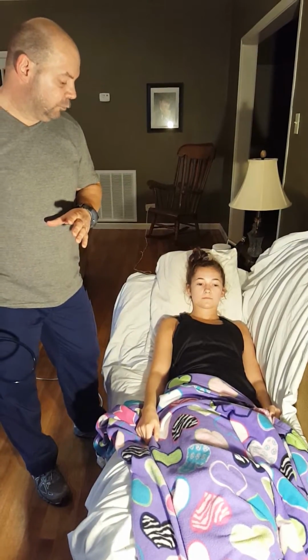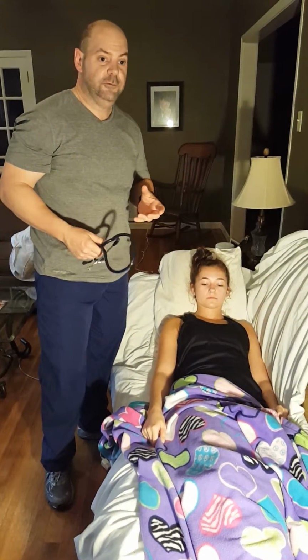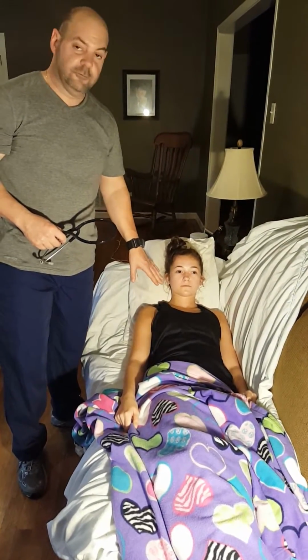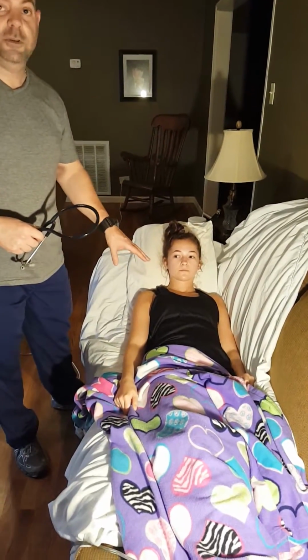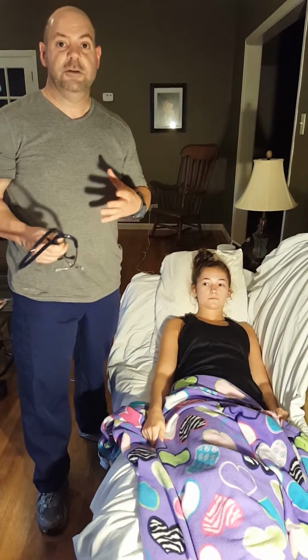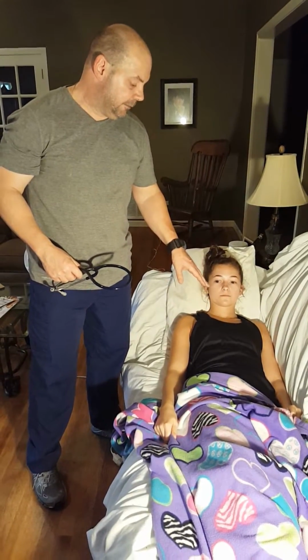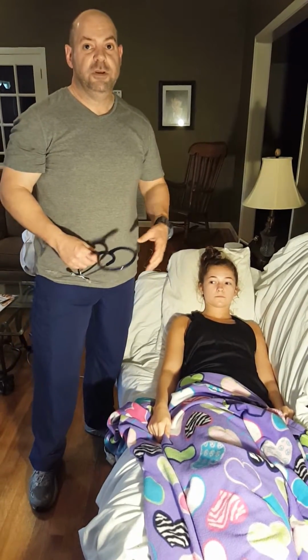If we had difficulty distinguishing the S1 from the S2, what we could do is listen, and at the same time we're auscultating, also palpate the carotid pulse, and that would determine the S1 sound for us. Then on S2, if we were having difficulty distinguishing our S2 sound, we could auscultate in the 2nd to 3rd intercostal space, and the heart sound that we would hear on late inspiration would be our S2.